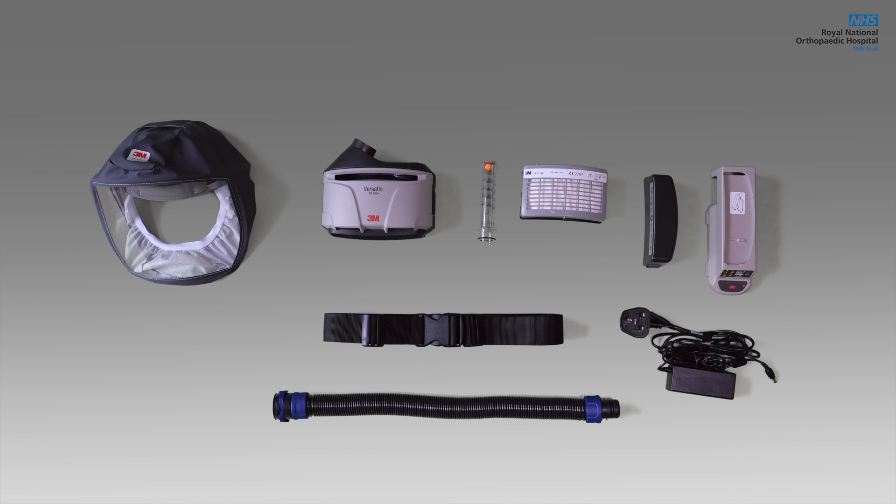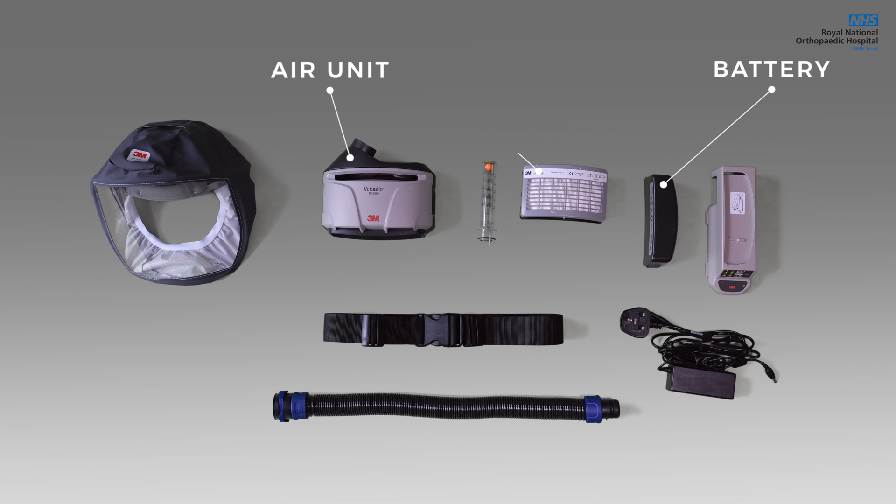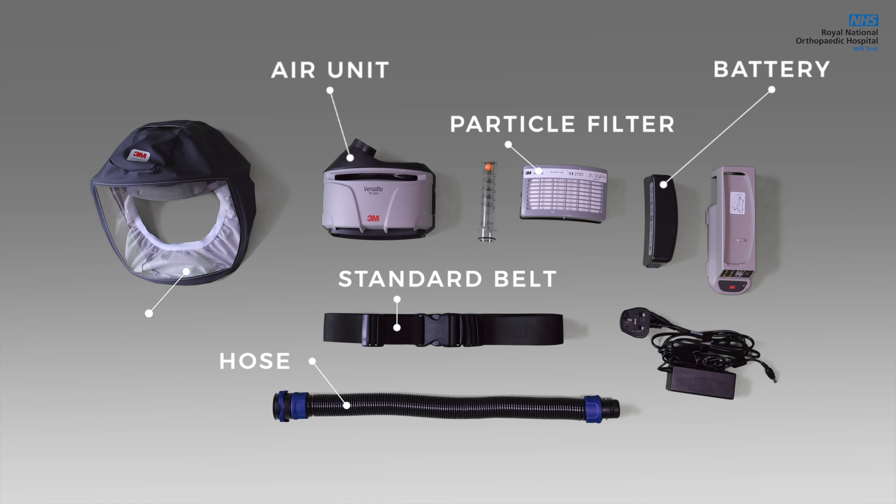In this video, we will show you how to correctly use and decontaminate the 3M Versaflow Powered Air Purifying Respirator. The set contains the following: the air unit, battery, particle filter, standard belt, hose, and the hood.